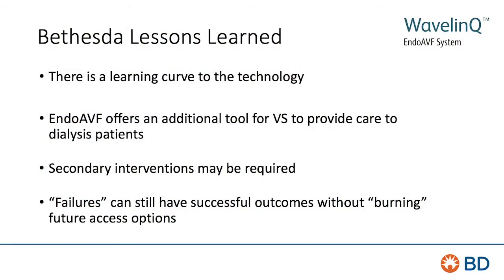Well, everybody's going to learn their own lessons, and that's kind of a personal experience. But now that I'm over 100 of these down the road, the things that I have come to appreciate is that there's a learning curve. The anatomy that we deal with is not standardized, especially on the venous side, and the technical nuances of doing the procedure are different from case to case.